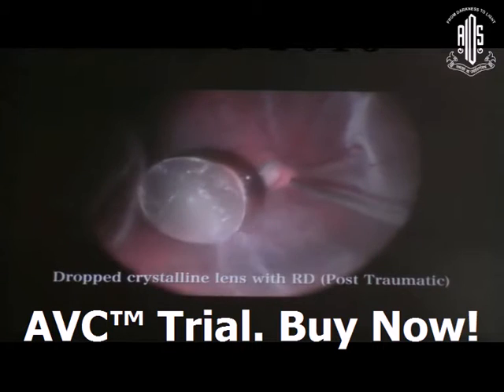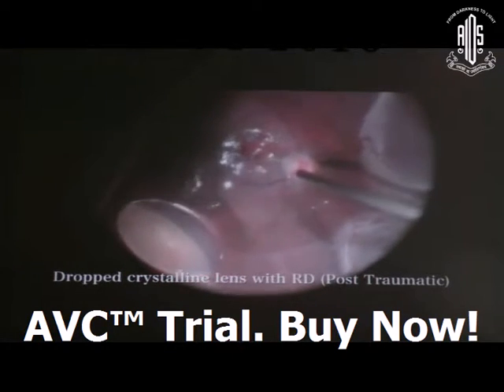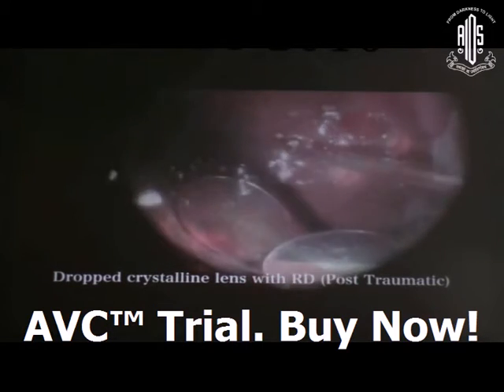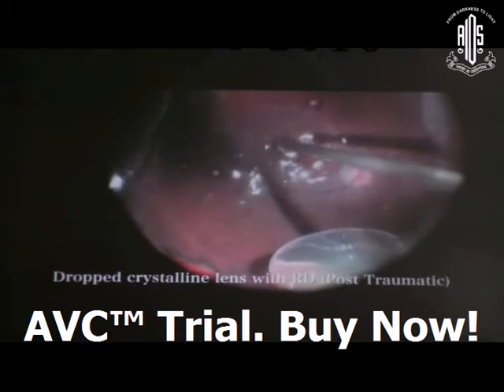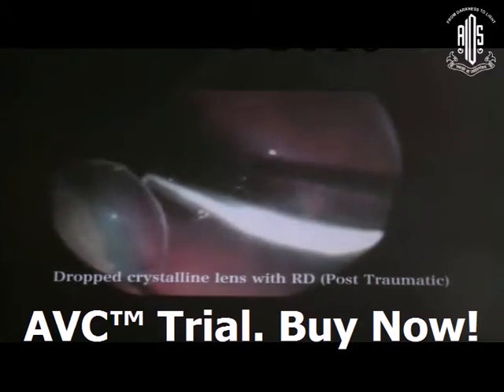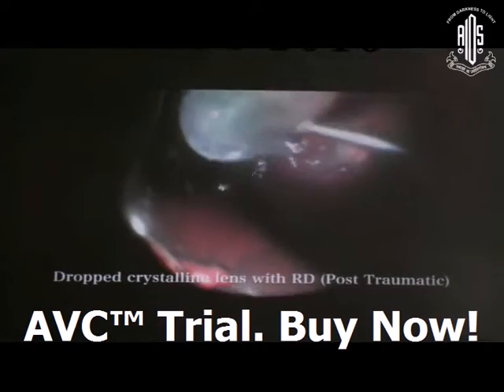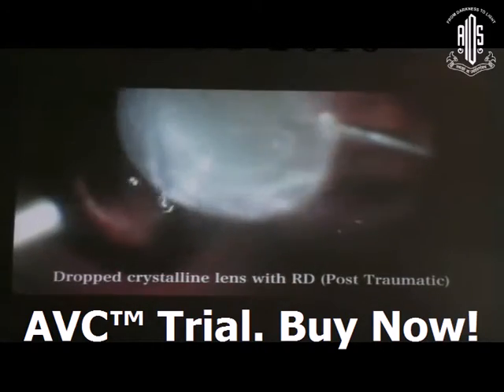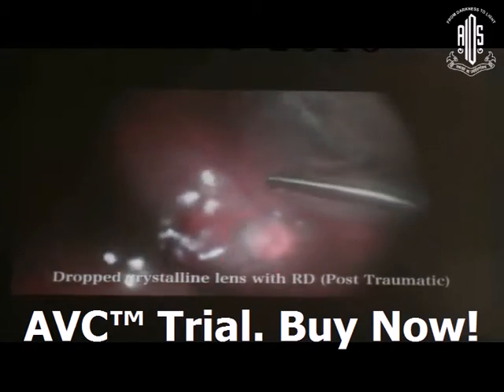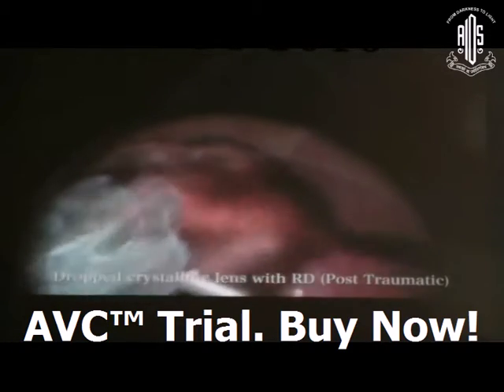You have to use PFCL and inject it just behind the crystalline lens. The configuration of the PFCL anterior superior surface is convex, so the cataractous lens will go to the periphery. Try to bring it centrally and manage with the cutter only. In this young patient, using only the cutter for the lens is appropriate.